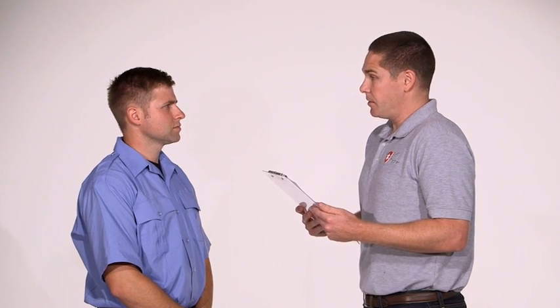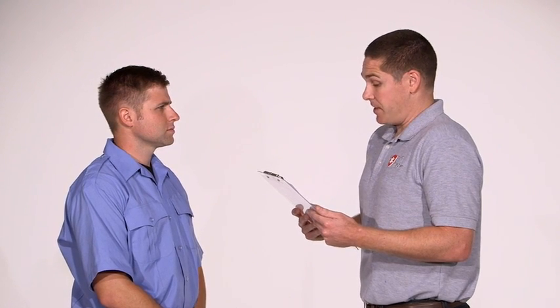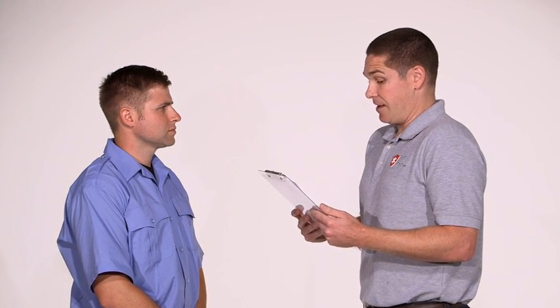Welcome to the IV and Medication Skill Station. These skills are designed to evaluate your ability to establish venous access in the adult patient and administer an IV bolus of medication. You will be given a patient scenario and will be required to establish an IV and administer an IV bolus of medication just as you would in the field. You will have 3 attempts and a 6-minute time limit to establish the IV.